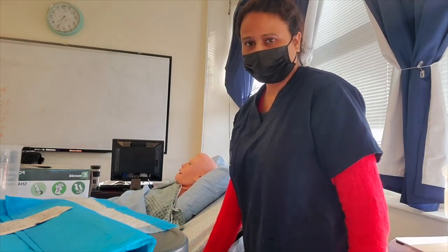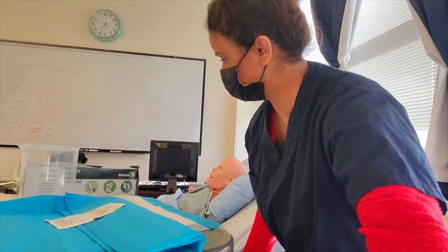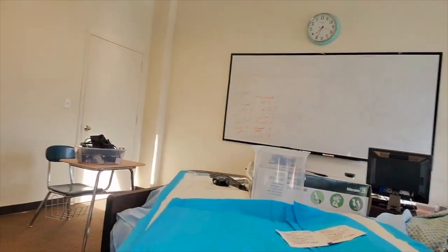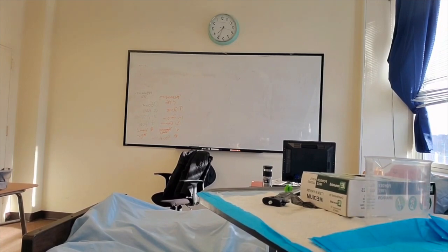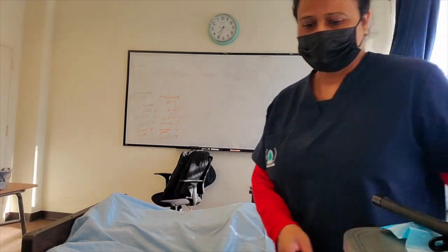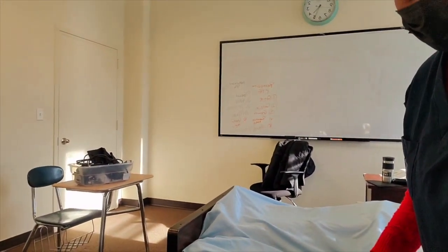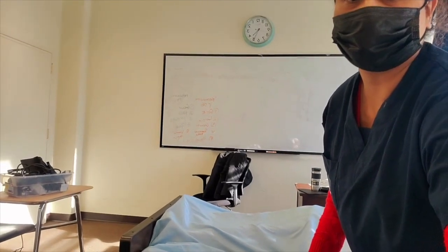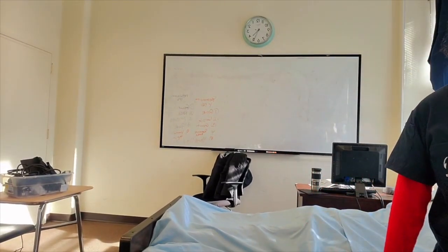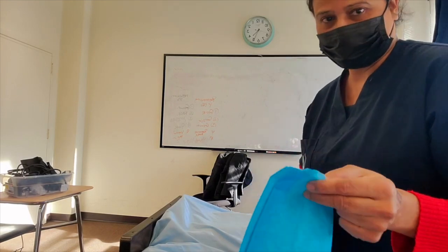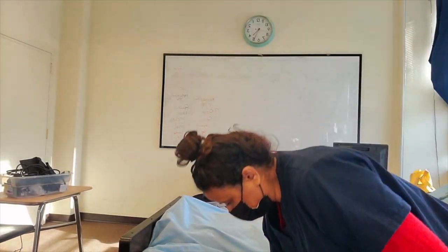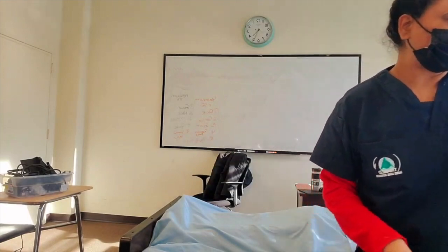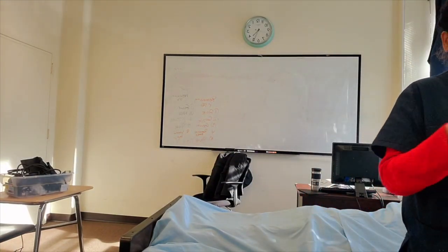I'm going to try to angle the camera so you can see exactly what I'm doing — it's sometimes hard. I have my barrier here, and I'm placing it on the floor. I'm taking my graduated cylinder and placing it on the floor, I have my alcohol wipe, and now I'm getting ready to apply my gloves.